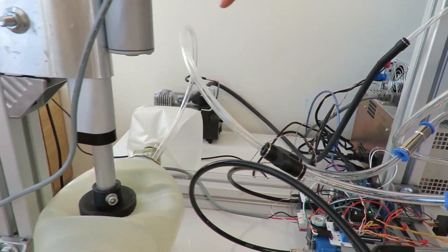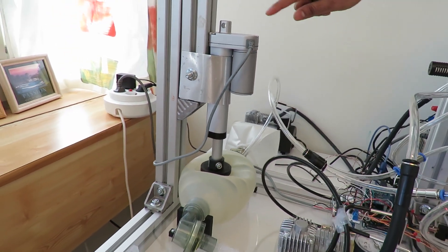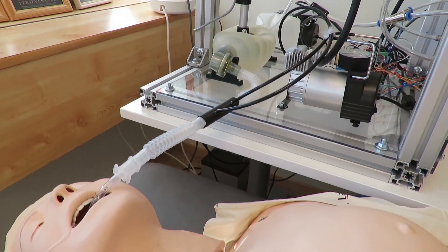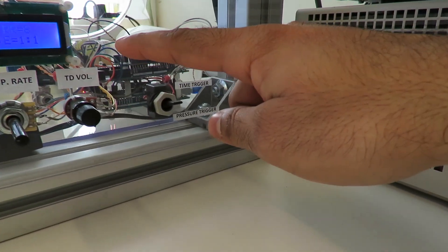The mixed air and oxygen are pumped into the patient's lungs with a medical ambu bag pressed with the help of a linear actuator. Depending on the stroke length and the speed of the linear actuator, the tidal volume, respiration rate, and the inspiration-expiration ratio can be controlled to the set values in the control knobs.